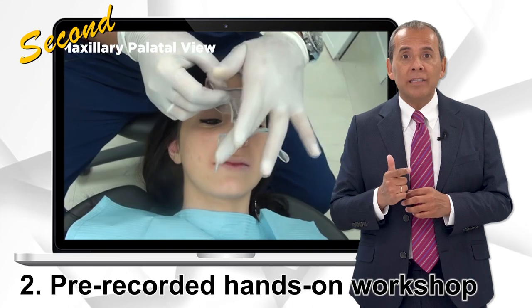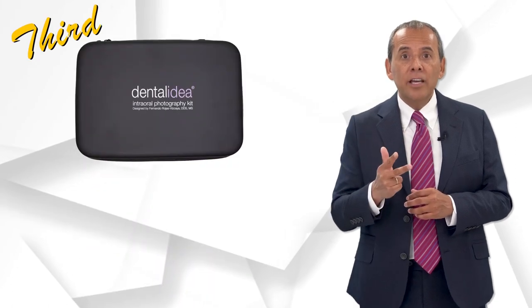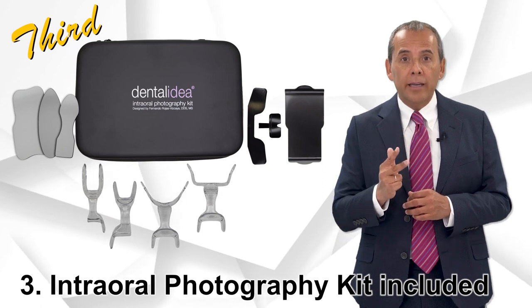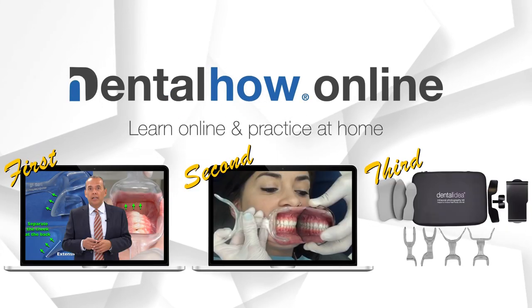Second, the pre-recorded hands-on workshop where you will see how to take intraoral photos. And third, we will send you the same intraoral photography kit used during the workshop. So, you can learn online and practice at home.